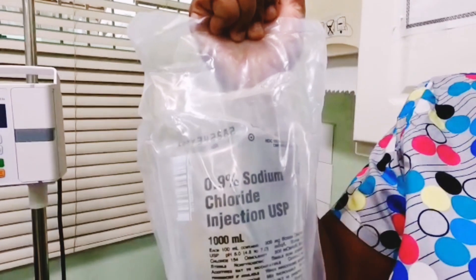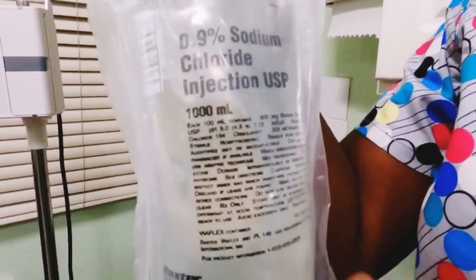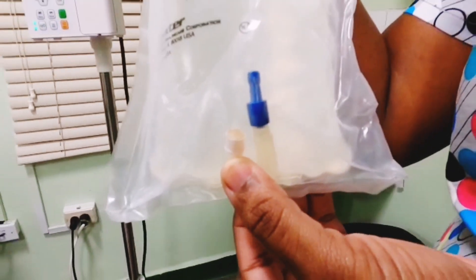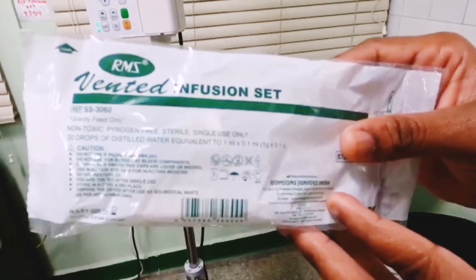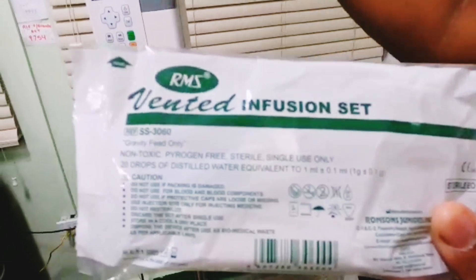We are going to do a demonstration of 0.9% sodium chloride injection 1000 ml. We have two ports — one for medication insertion and one for IV line insertion. This is the IV line infusion port.